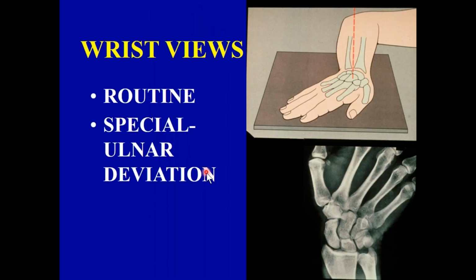And similarly, if I can do ulnar deviation views, I can do a radial deviation view. That just means now we're turning the hand, or the wrist, inward towards the thumb, and that will show if there are problems with the fourth and fifth digit, especially if the patient decides for whatever reason to hit the drywall or the wall. When he or she does that, they have a likelihood of fracturing the fourth and fifth heads. Not an uncommon injury, but the principle is the same. If I can make the scaphoid bigger by doing ulnar deviation, I can make the other structures larger by going through radial deviation.